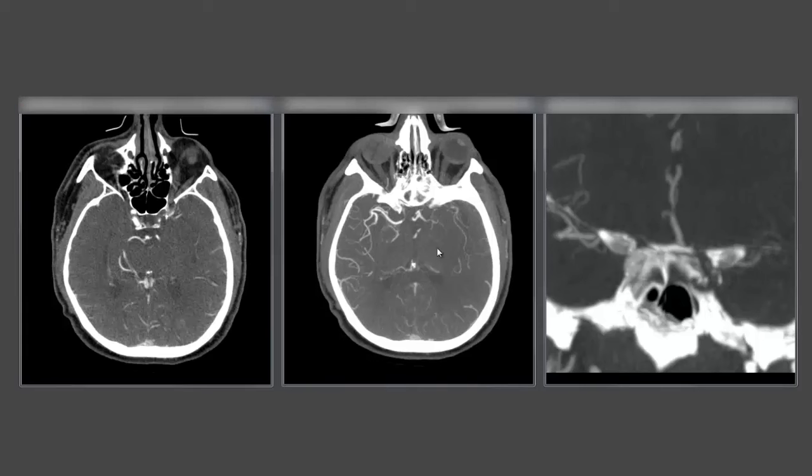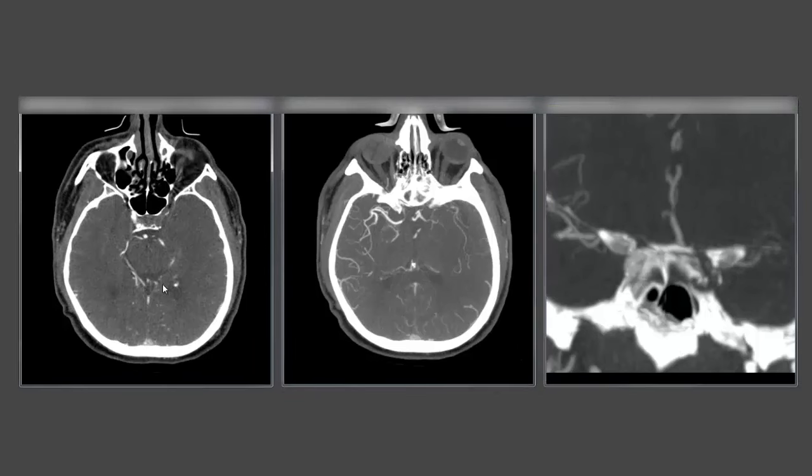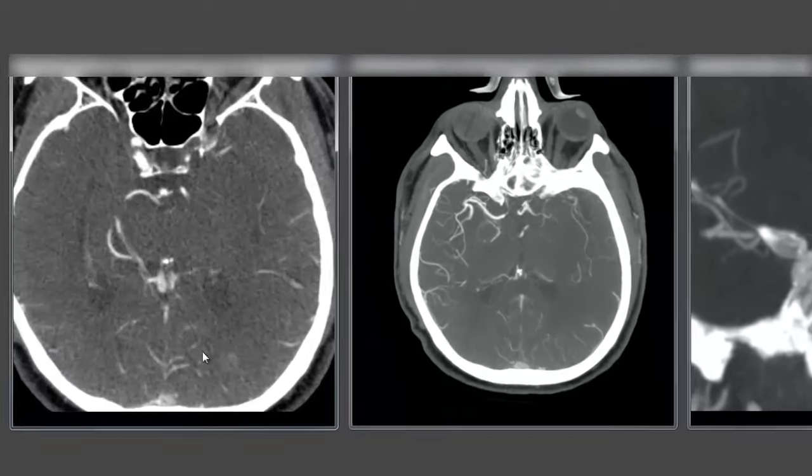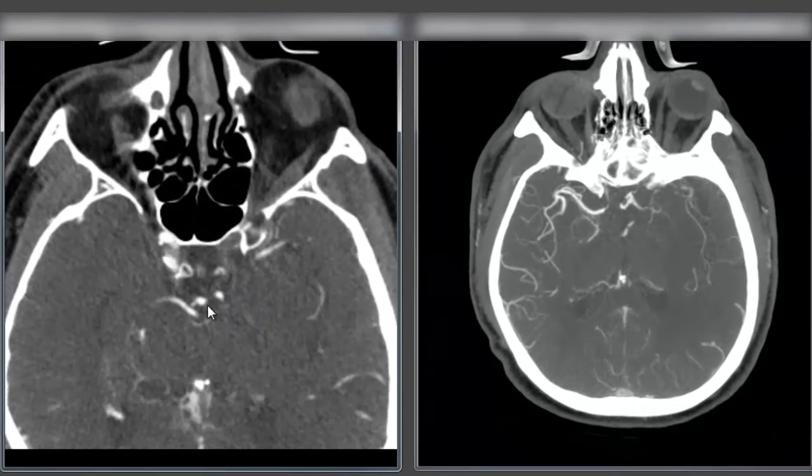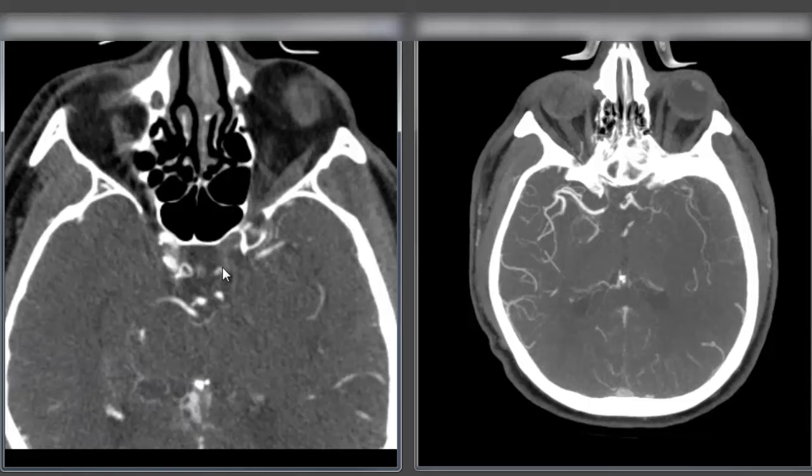So we have our source images, we have our thick MIP reconstructions in the axial and coronal planes. If we look at our source images right away we can see there's significant asymmetry in this patient presenting with an acute stroke with right hemiparesis, aphasia, and left gaze deviation.